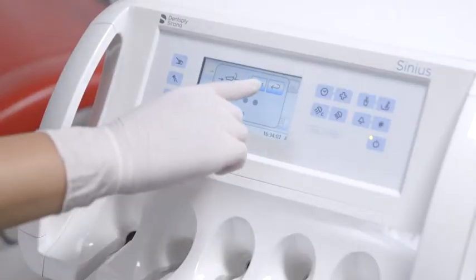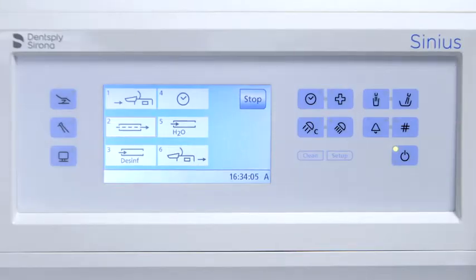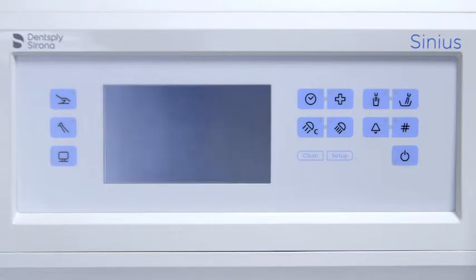You can follow the progress of the individual steps on the easy touch. When it reaches step four, the treatment center automatically switches to standby mode. Allow the Dentosept S disinfectant for the water lines to act for at least 24 hours.